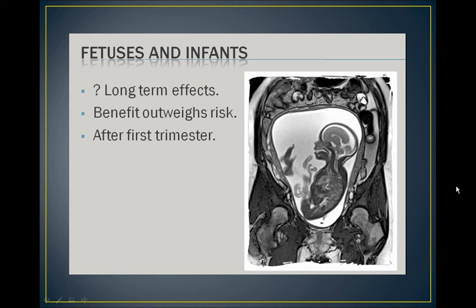In 1991, the Safety Committee of the Society of Magnetic Resonance Imaging issued a statement as follows. Quote, these patients should be informed that, to date, there have been no indications that the use of diagnostic MRI imaging during pregnancy has produced any side effects. End quote. This policy has been adopted by the American College of Radiology and is considered the standard of care for MRI procedures with respect to pregnant patients.